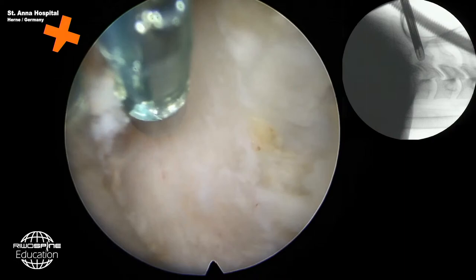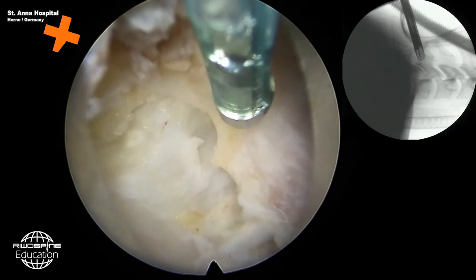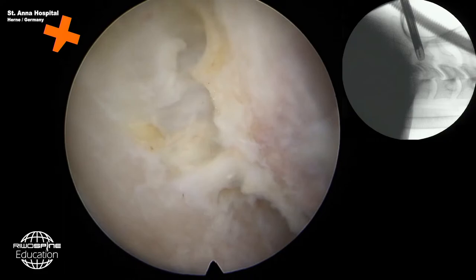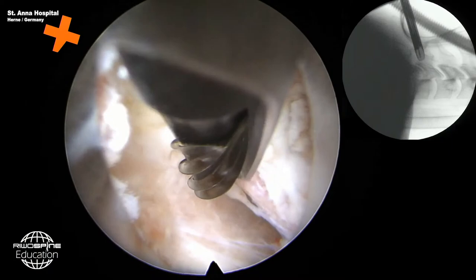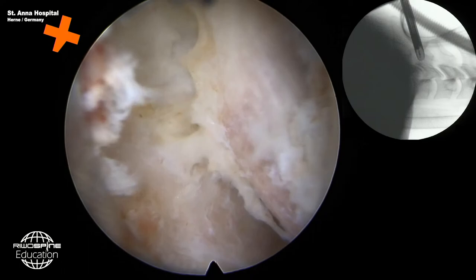So now I have to start with bone work. Bone work means at the cervical spine, especially when you're not able to identify where the cervical nerve is, and this is nearly impossible, you should resect enough bone from cranial to caudal. If you're not sure, resect bone from the cranial to the caudal pedicle.